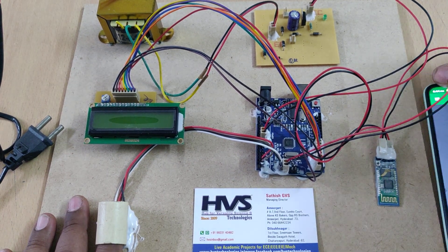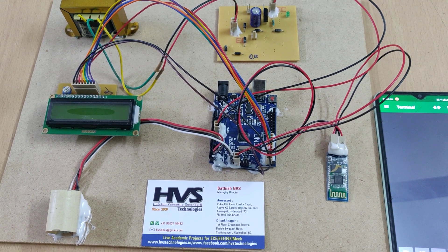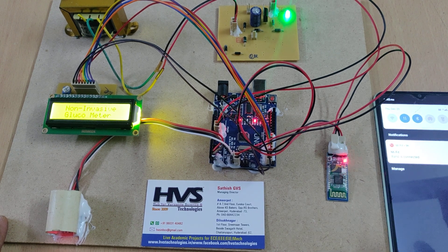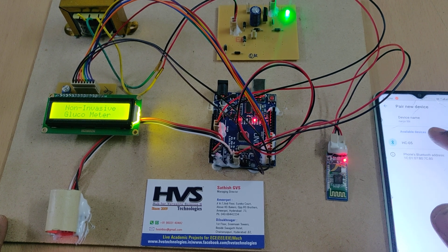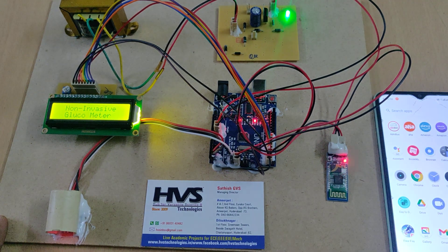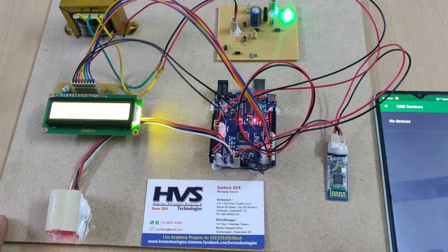Before switching on the kit, install the Bluetooth terminal application. After that, switch on the power supply and go to Bluetooth settings in your phone. Search for a new device — HC-05 — and enter the password 1234. This is the initial setup required on every phone. Then open the application installed from the Play Store.